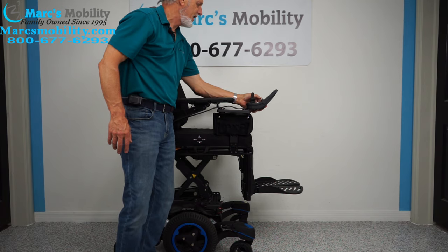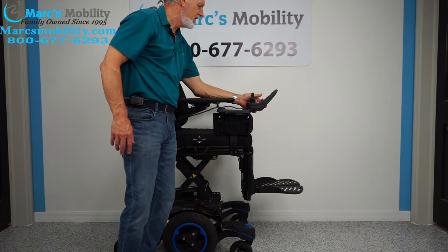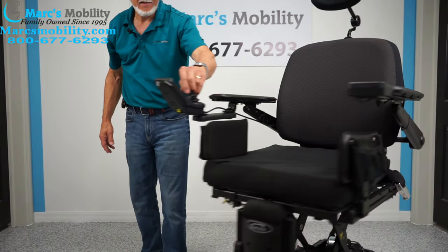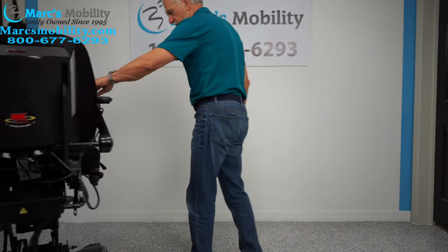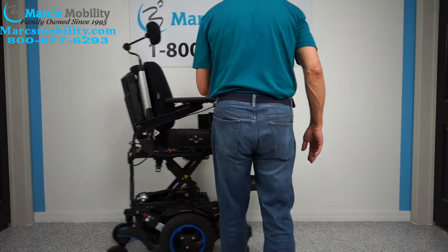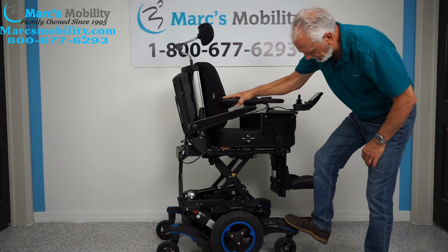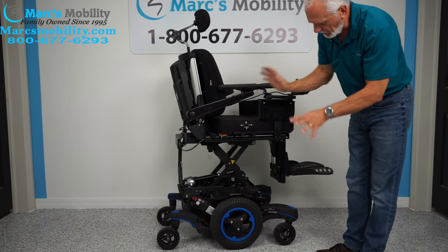I'm going to put it back in speed — there are five speed settings — and you can still drive this chair very fast with the seat elevated, as you can see.